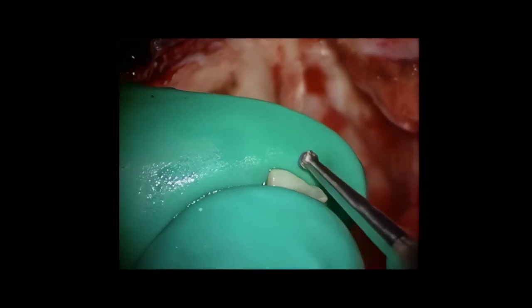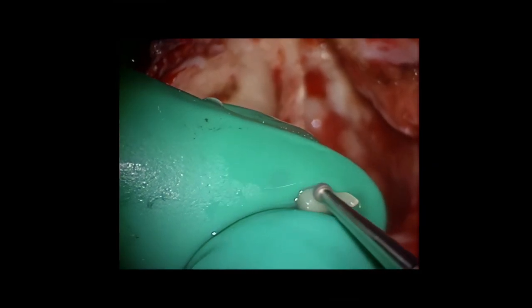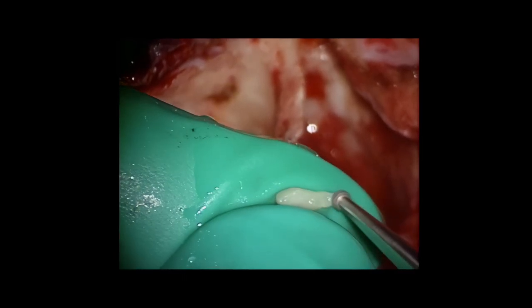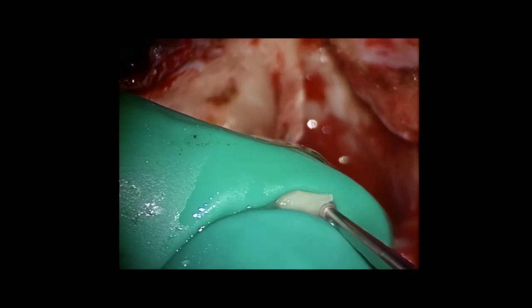Now I am removing some of the bulk mass of the incus. And now I am lowering the profile so that the incus is not excessively high and allows for a good connection between the stapes and the malleus long process.